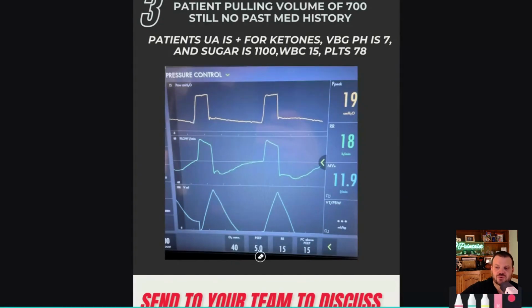The thing that you can't do is just override this patient's rate. It's hard to override a patient's rate if they're breathing spontaneously with the ventilator. If you wanted to do that, you'd have to sedate and or paralyze more. But again, remember, you're going to be at that point at the complete mercy of the pulmonary physiology as to not give them auto PEEP with the vent.